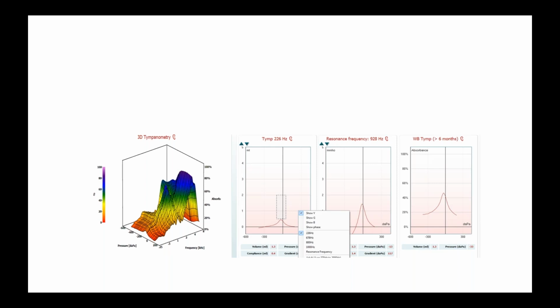Ma'am, the next question is regarding the cases of otosclerosis, where sometimes we see the notch in the bone conduction, the Carhart's notch. You showed us some wideband absorbance patterns for otosclerosis versus normal. So does the Carhart's notch get reflected in the wideband absorbance patterns? Could you explain that a bit?